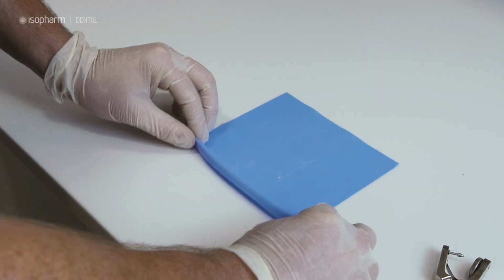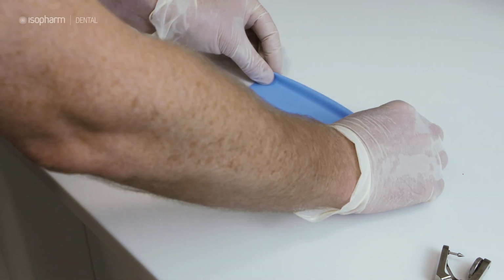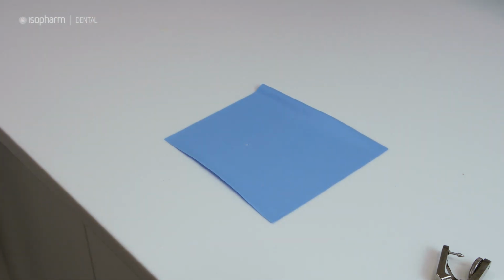And by doing that, and by simply rotating that dam and flipping it, you could have top right, bottom left, top left, all by punching that hole in the same place. Keeps it nice and simple, nice and consistent for your nurses.